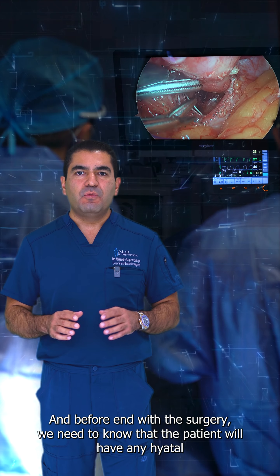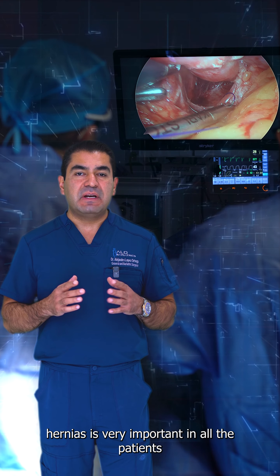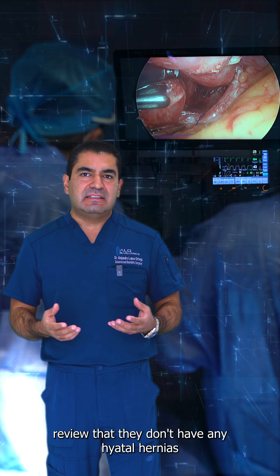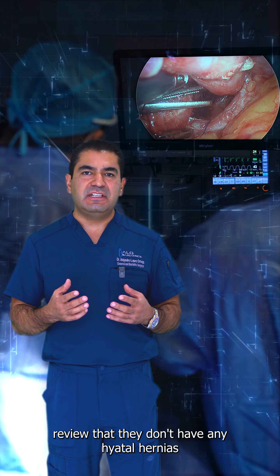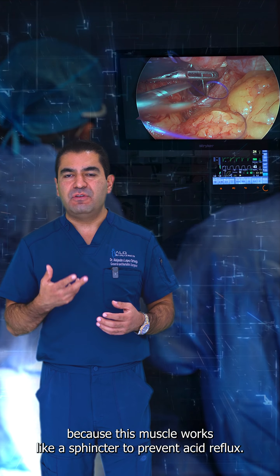Before ending the surgery, we need to know that the patient doesn't have any hiatal hernias. It's very important in all gastric sleeve patients to review that they don't have any hiatal hernias, because this muscle works like a sphincter to prevent acid reflux.